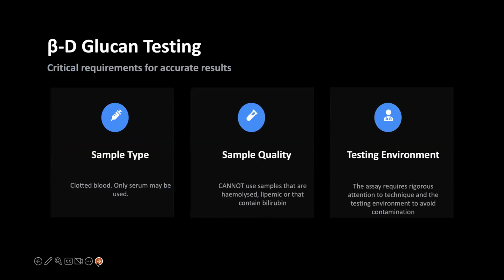So specifically, the reason that the beta-D-glucan test requires a separate specimen is that this specimen can't be shared between departments. For some labs like ours, it is a referral test, and it is a very sensitive assay, and contamination can easily result in false positives when you are sharing or splitting samples between departments or between tests.